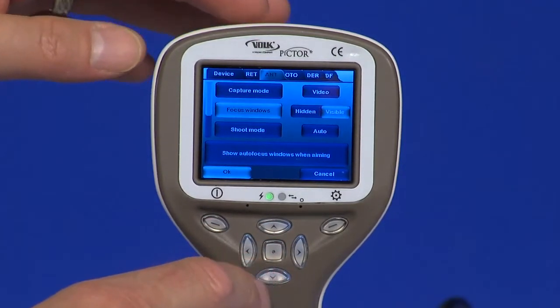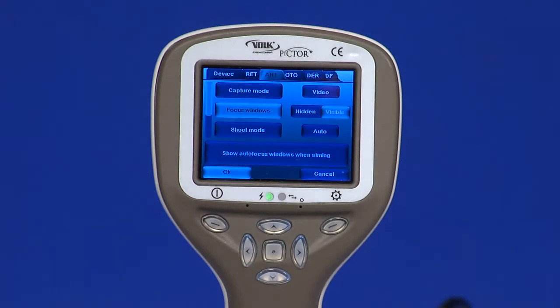Focus window: the focus window helps the user position the image. It can be moved on the screen by first pressing the middle key until icon F appears in the top right corner of the display, and then using the arrow keys when aiming.